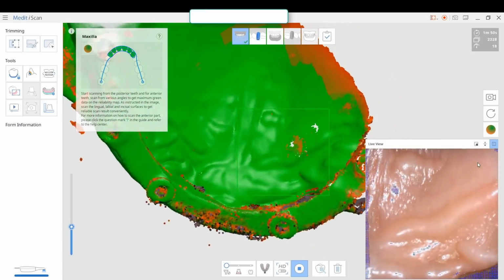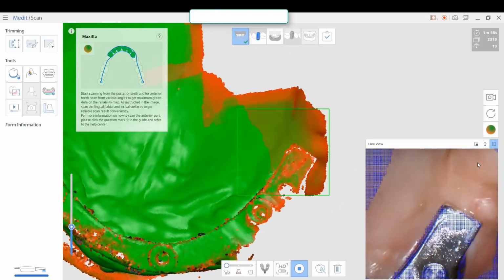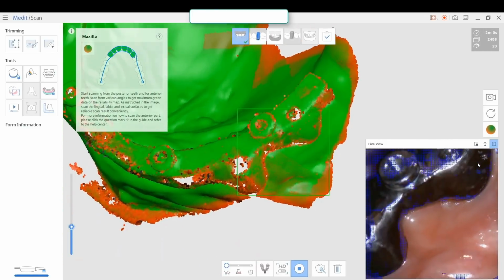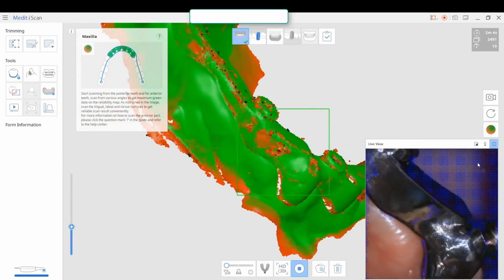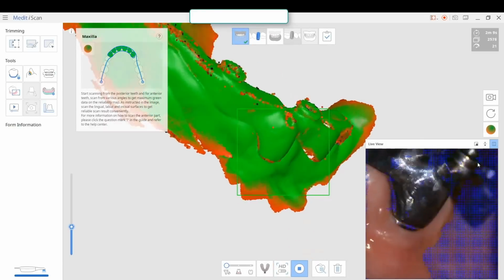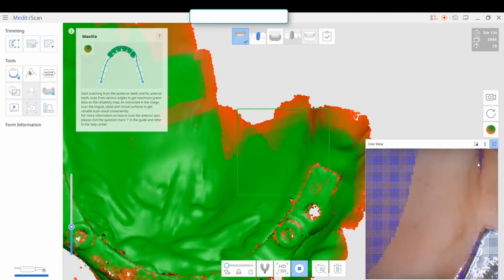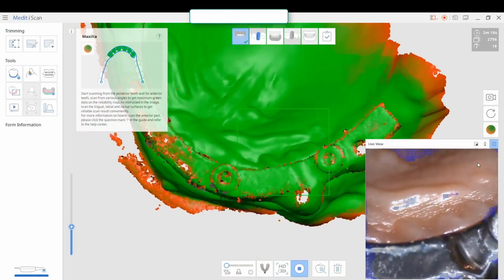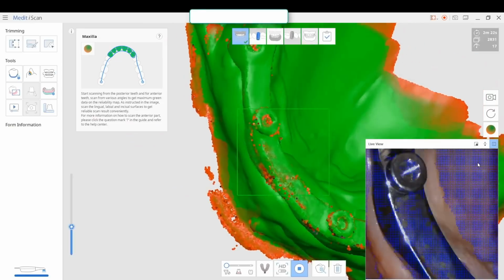And then I go back to previous areas and I angle the camera to pick up more data. So I'm routinely going back to a reference frame or a purchase point to remind the software where it is, so that it can see previous data and build upon that and eliminate any discrepancies between the current live stage and where I've had a pass through already. Once I complete this and I see areas where there are holes, I'll go back over it with the scanner and try to fill them in.